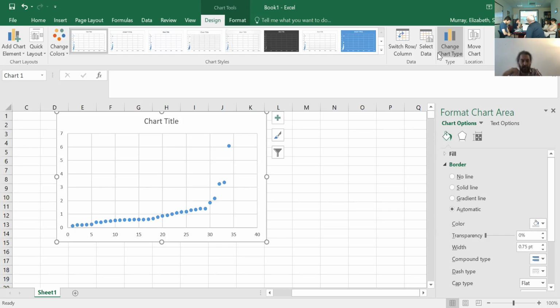typically indicative of how much noise you're going to get in your first level estimates, right? So when you're looking at speech minus baseline, the more data that you have, which effectively is the more valid scans that you have, the less residual error you're going to get, and the more robustly you're going to estimate the speech minus baseline effect. So that's why it's a good measure, even though it might not depend only on motion, it might also depend on other factors like the actual number of scans that each subject underwent. It is still a very good indicator of how good data you have for each subject. So that's also a potentially good covariate to introduce in the second level. Okay, I'll take a peek at that.